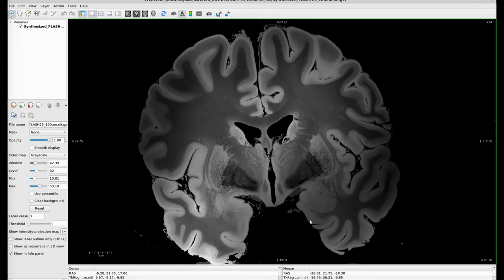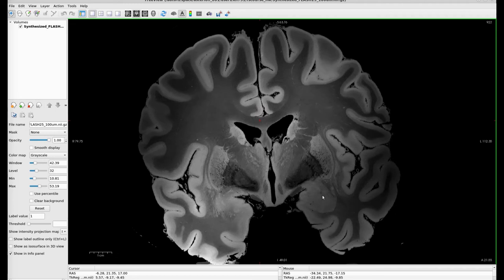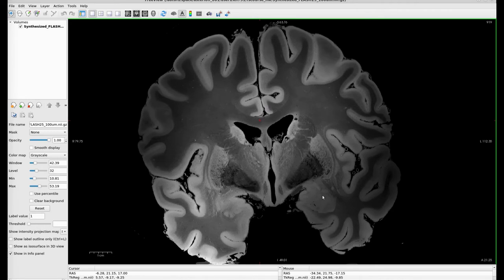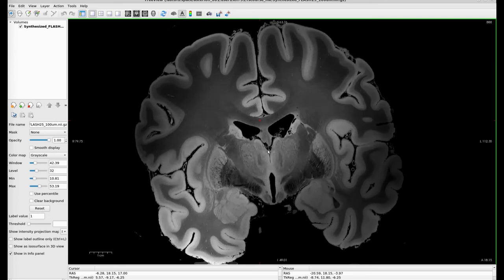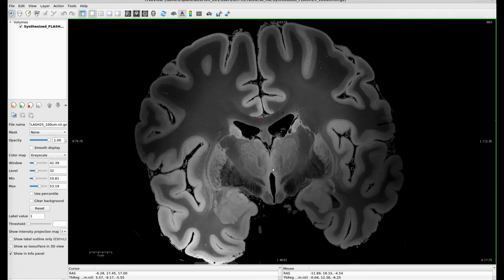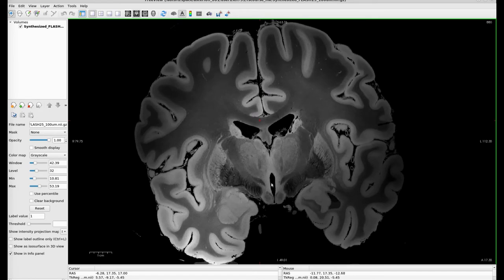Continuing along our tour of the brain, we're starting to see parts of the limbic system. This is the medial temporal lobe, one of the memory centers of the brain. And we're seeing the amygdala here — this large structure here and here. As we scroll further in the posterior view, we start to see the thalamus pop up as well. Now we can see bits of the third ventricle right down here and mammillary bodies in this inferior portion of the brain.